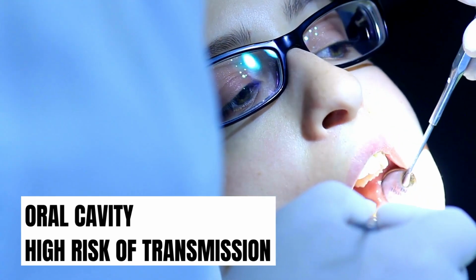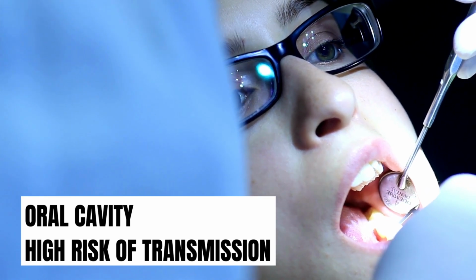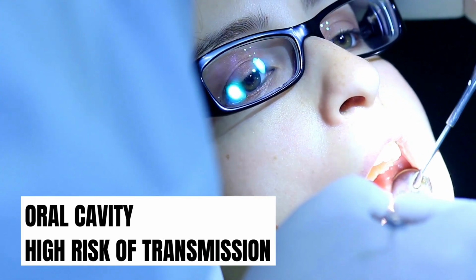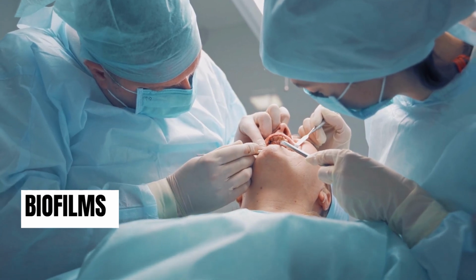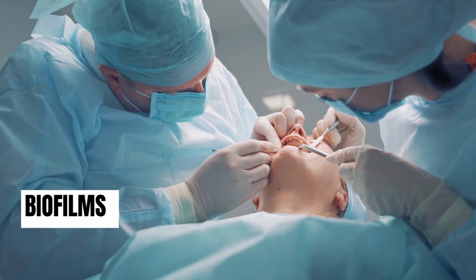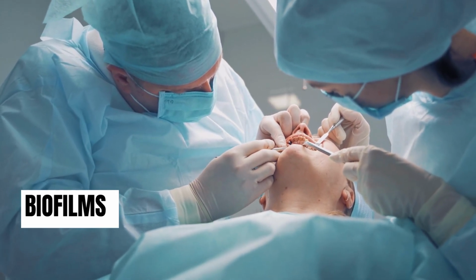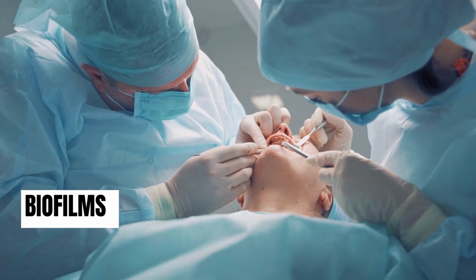The handpieces used in dental treatment can act as a source of infection, not only to the patient but it can also infect the operating surgeon. The biofilms formed in the dental unit waterlines could be spread by aerosol created by a dental handpiece, and it presents a risk to both patient and the operating surgeon.